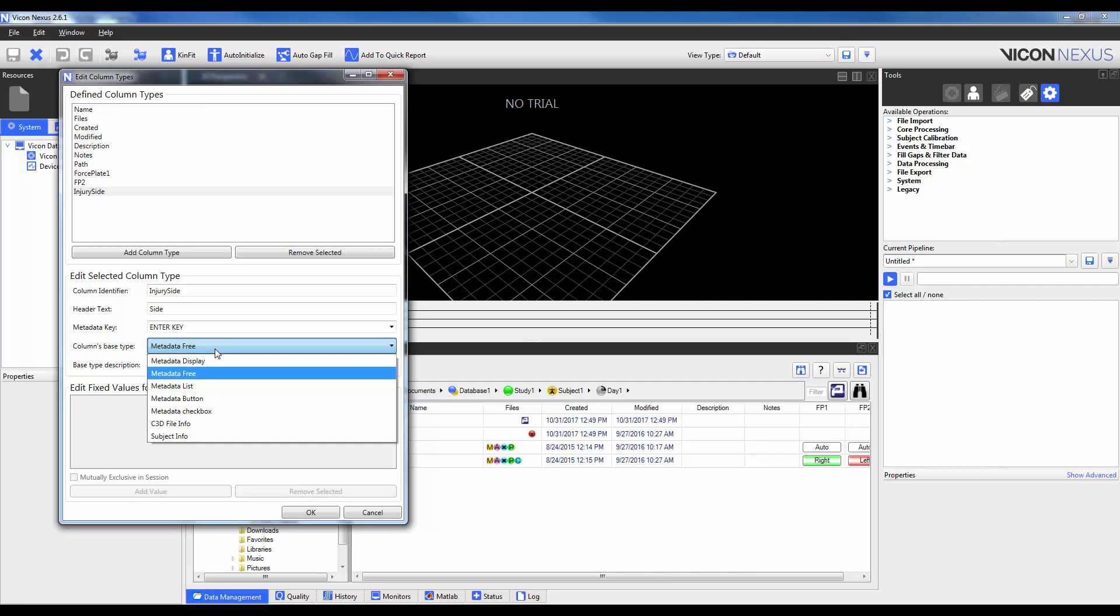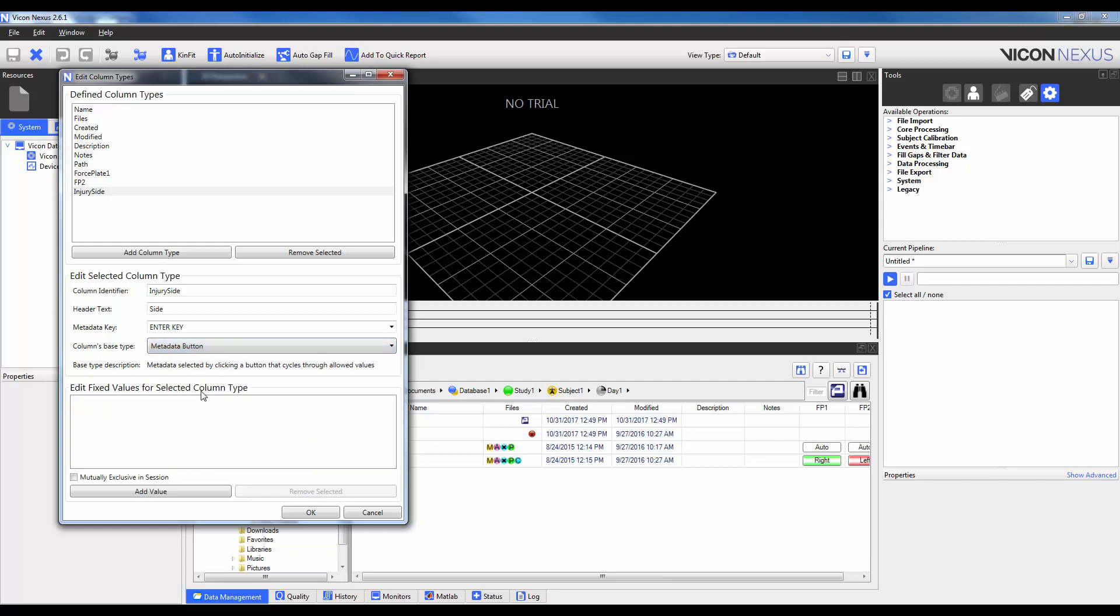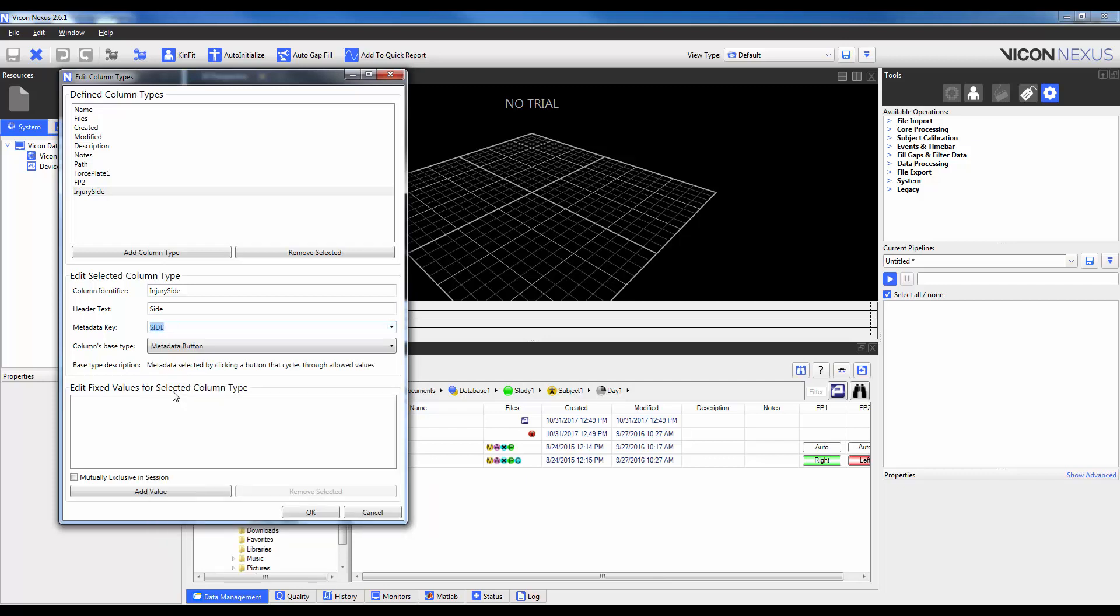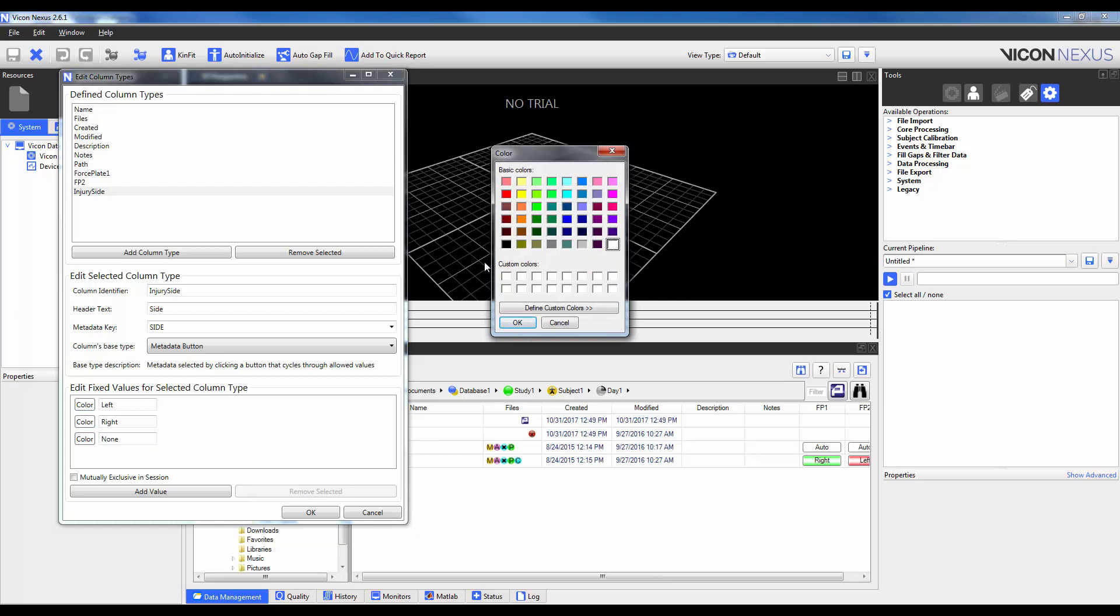So the first thing I'm going to show you actually is the metadata button. So I'm going to select that. And then I'm going to go ahead and select a metadata key. The metadata key is the variable used to save the contents of that column to each trial's ENF file. So I'm going to go ahead and select side here. Because this is one of the pre-allocated ones, you can also go ahead and type in your own individual one and it will create a new variable within that ENF. So a metadata button is actually going to function similar to the Force Plate. So it will allow a user to toggle between preset selections. So I'm going to go ahead and add in a left, a right, and none.